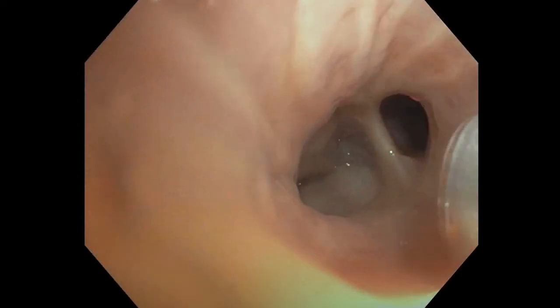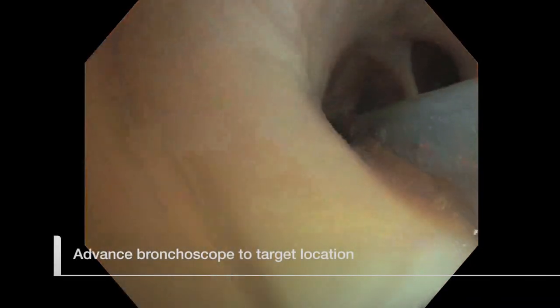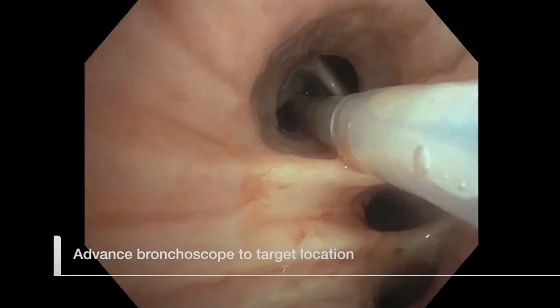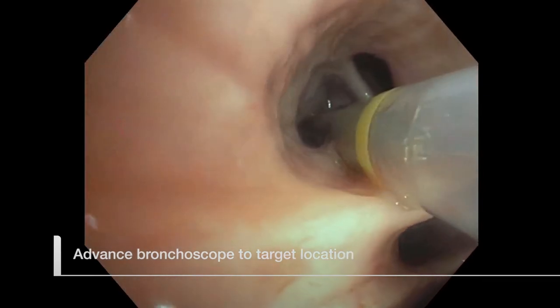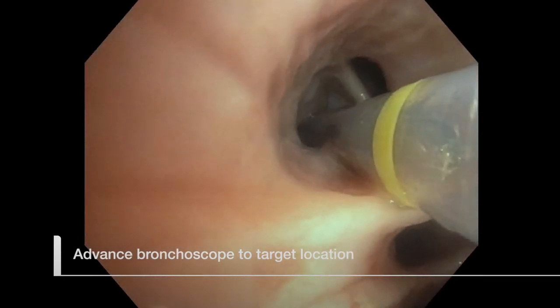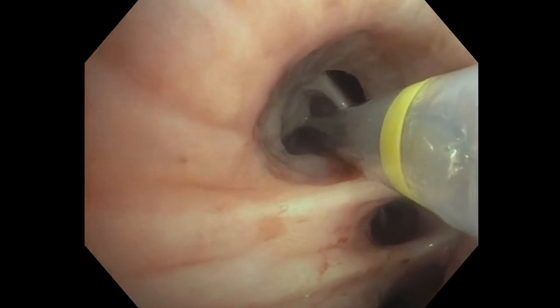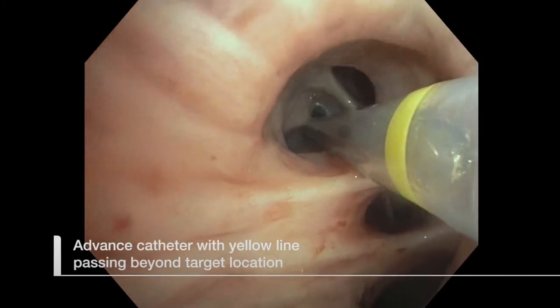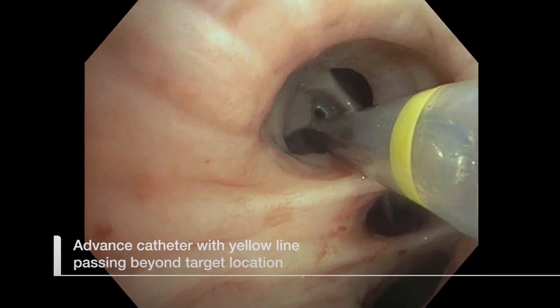Under bronchoscopic observation, advance and position the bronchoscope so that the target airway location is visible and the tip of the catheter can be directed into the target airway site without bending or kinking the catheter. Advance the catheter so that the yellow valve line passes beyond the target location using the same angle as the sizing balloon.